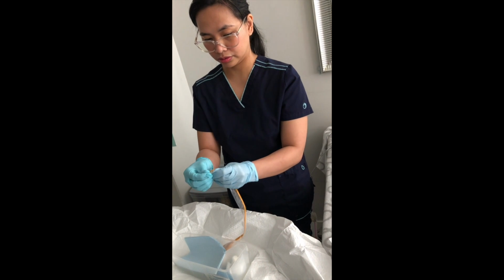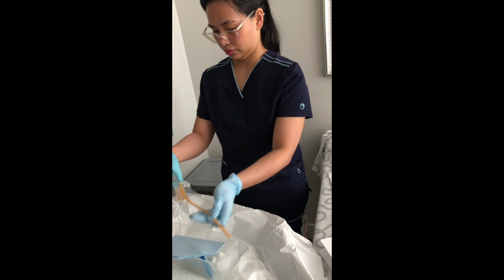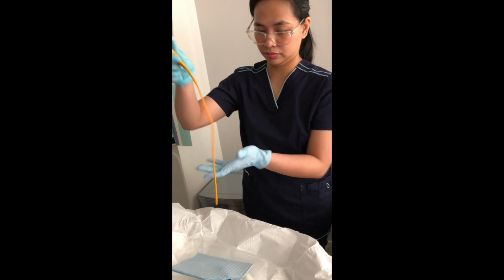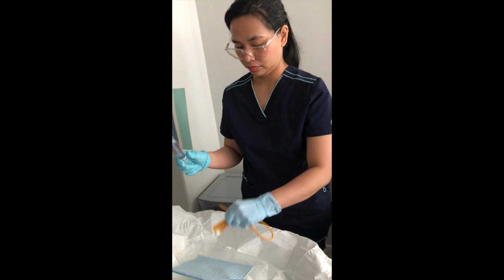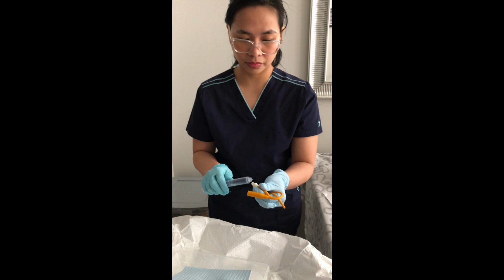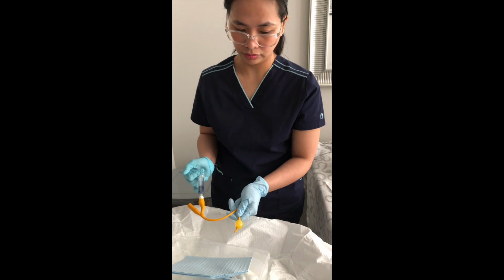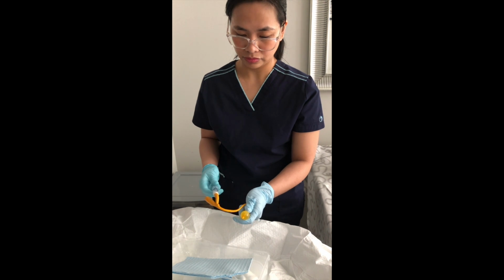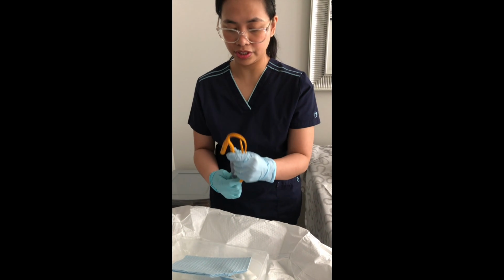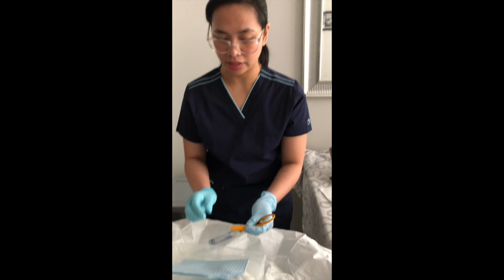Open up the catheter and check for the balloon, just to make sure that the balloon is intact. And then take out everything again. Make sure it's neatly arranged. You can leave the syringe here, and if there's no need to collect the urine, you can attach the bag. Make sure the bag is also sterile, and then you can just leave it here.